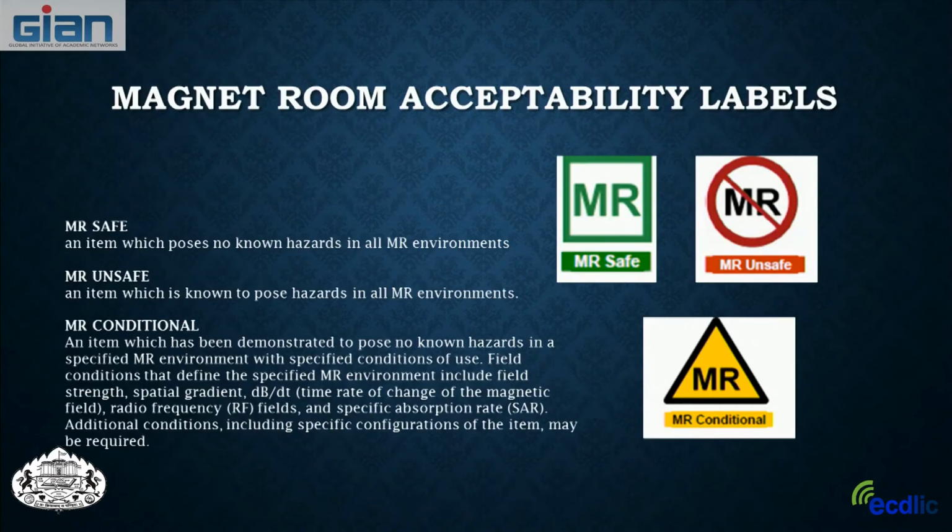So every MR center should have a map with these zones indicated, so that anybody who's using this area knows which zones they can bring their participants into without being screened, and which zones people are not allowed to pass into if they have not been screened. And this is taken very, very seriously at our center.